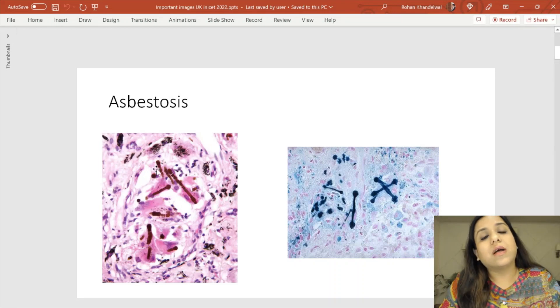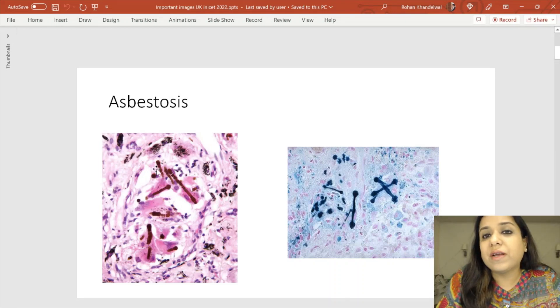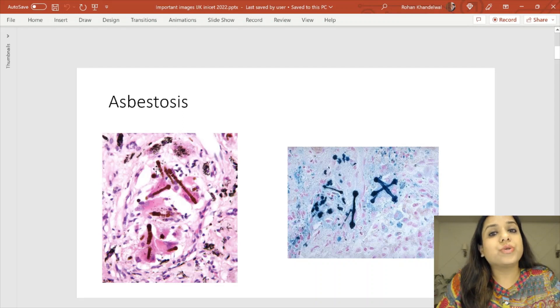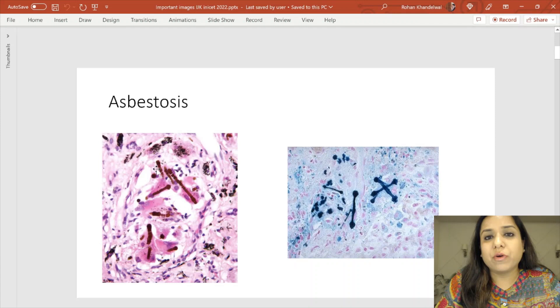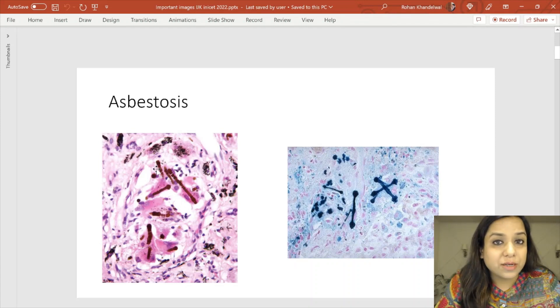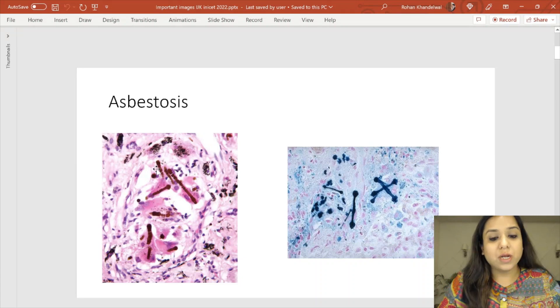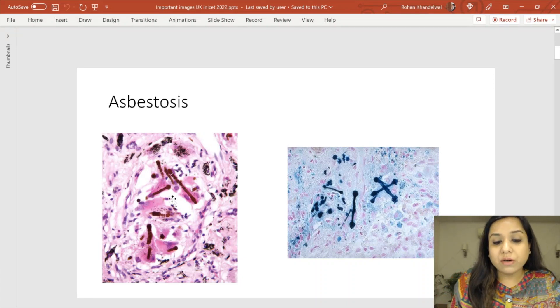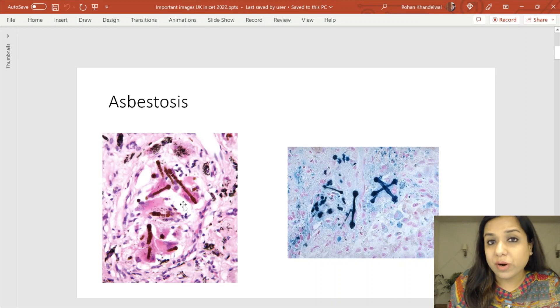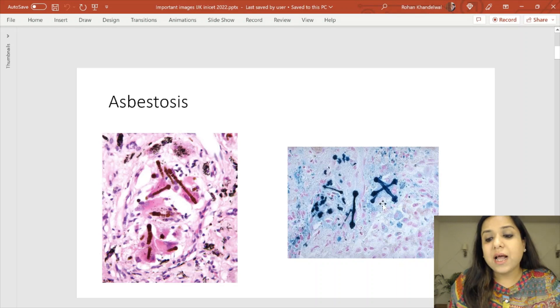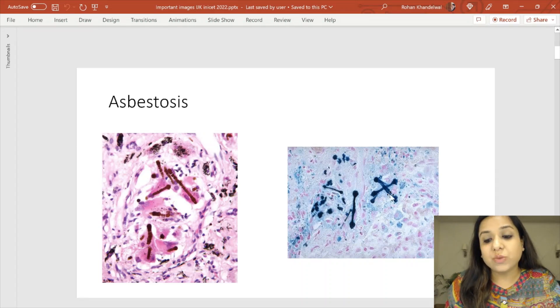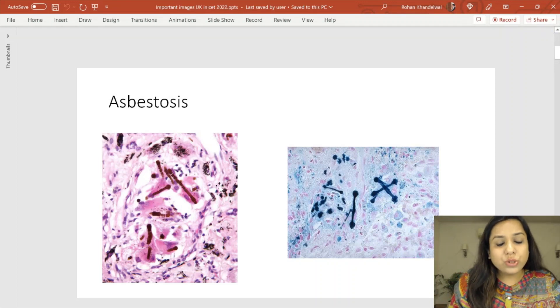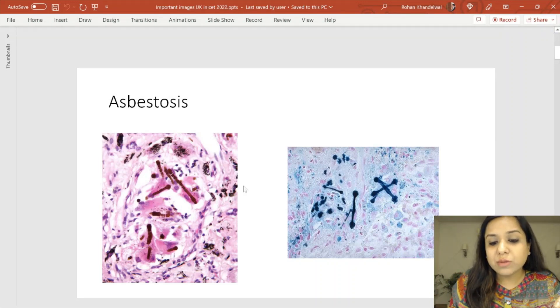In the MCQ exam, you can get a question about a 50 to 55 year old construction worker or someone in the shipping industry presenting with breathlessness, dyspnea, or cough with a biopsy from the pleura. The first image shows beaded fusiform rod-like structures — these are asbestos bodies. The image on the right shows dumbbell-shaped bodies which are Prussian blue positive, hence the blue staining.